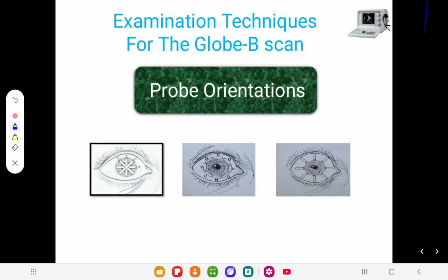So we are going to discuss the examination techniques of B scan. I have already said a little bit about it in our third video. This is the fourth video. In this, there are three techniques: axial, transverse, and longitudinal. So let's discuss it.